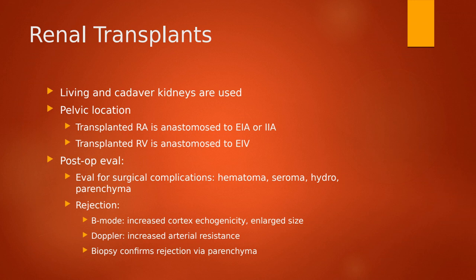Okay, so moving on to how we evaluate if a patient has a renal transplant. We should remember that if you have a transplanted kidney, it is not going to be placed in the same spot. It's going to be placed in your pelvis. So we need to be aware of that in terms of our scanning technique. We know that these are going to be located in the pelvic region.